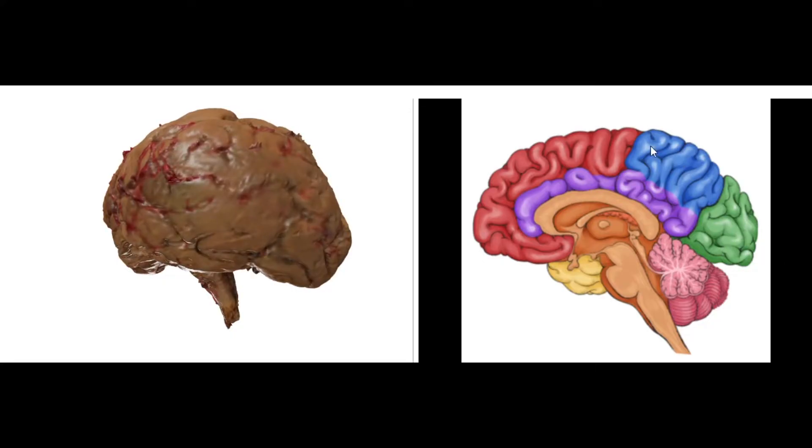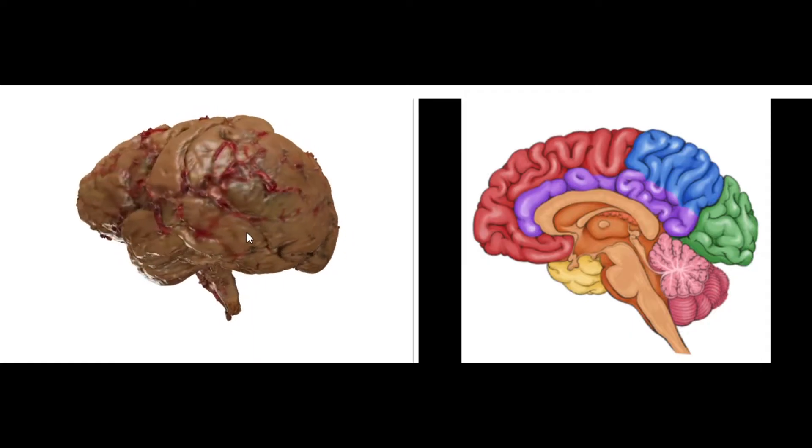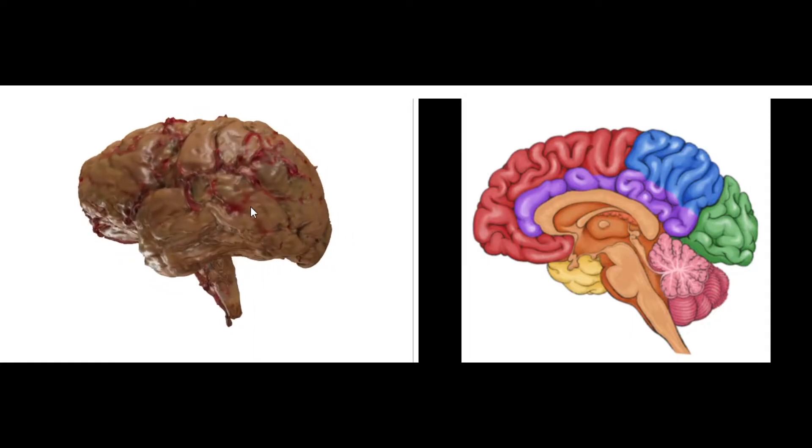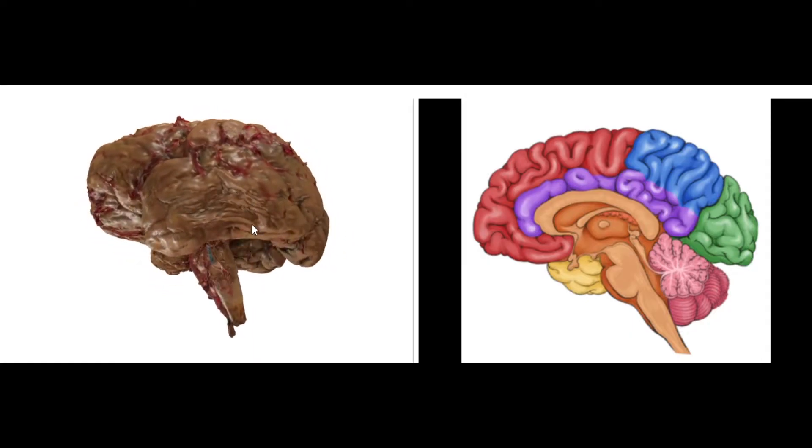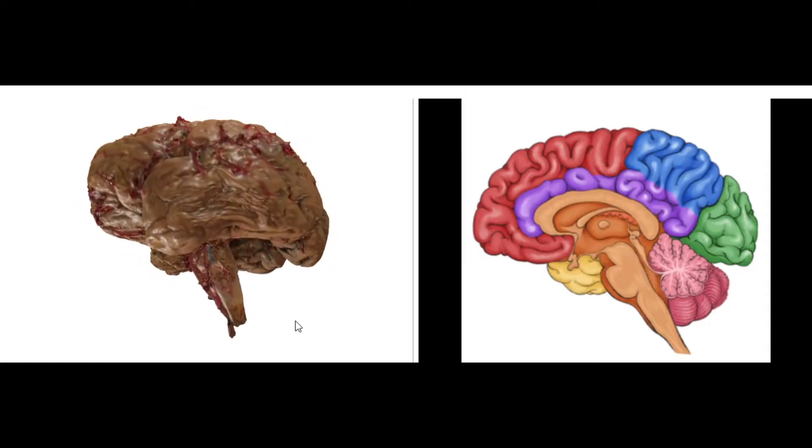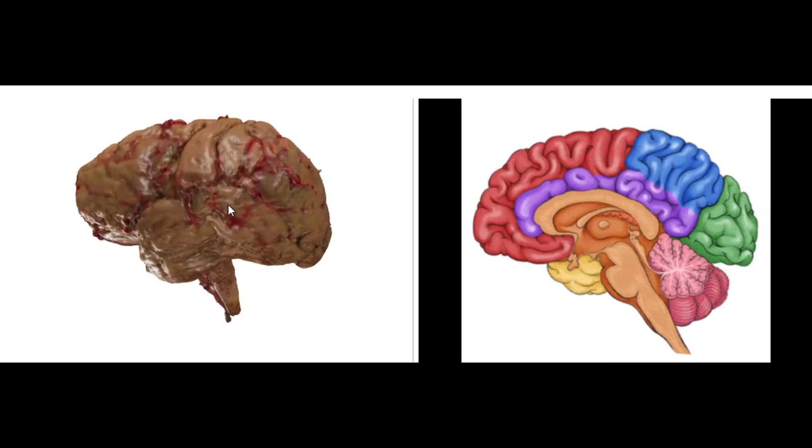So occipital, parietal, frontal, and temporal. And then we can see the brainstem here, the cerebellum is not in this model.